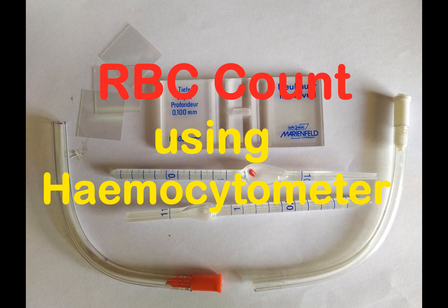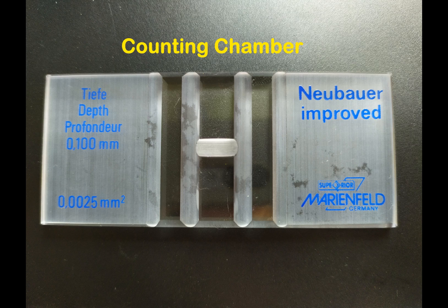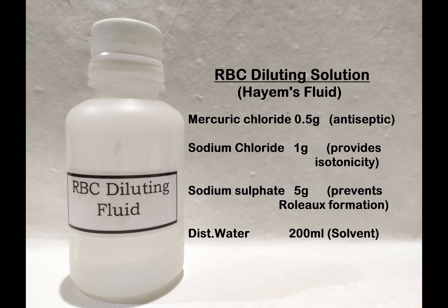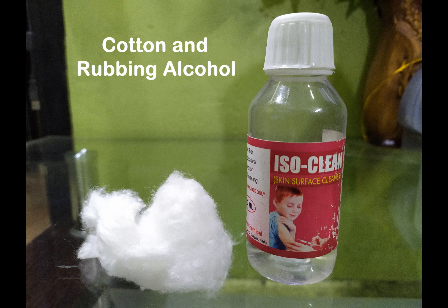You may use blood from any animal to count the RBC population. For this experiment, you will need the following: a counting chamber, an RBC pipette, a blood sample either from a pricked finger or from a sample drawn from the vein and stored in a tube containing an anticoagulant, RBC diluting solution, a compound light microscope, and cotton and rubbing alcohol.